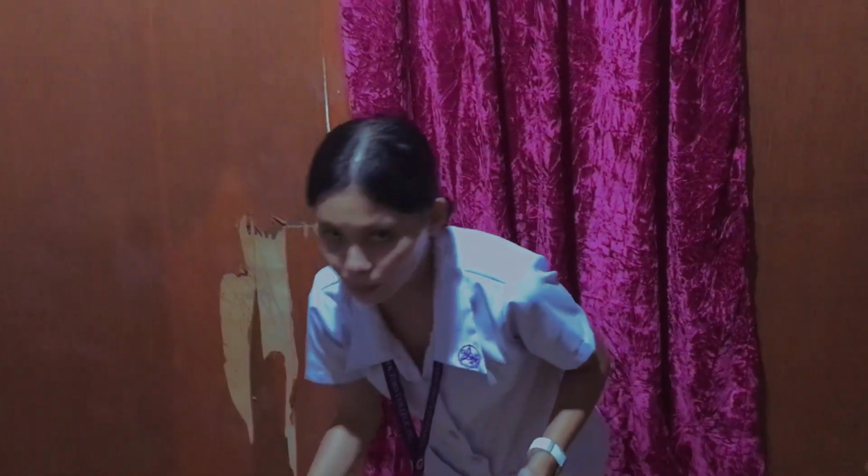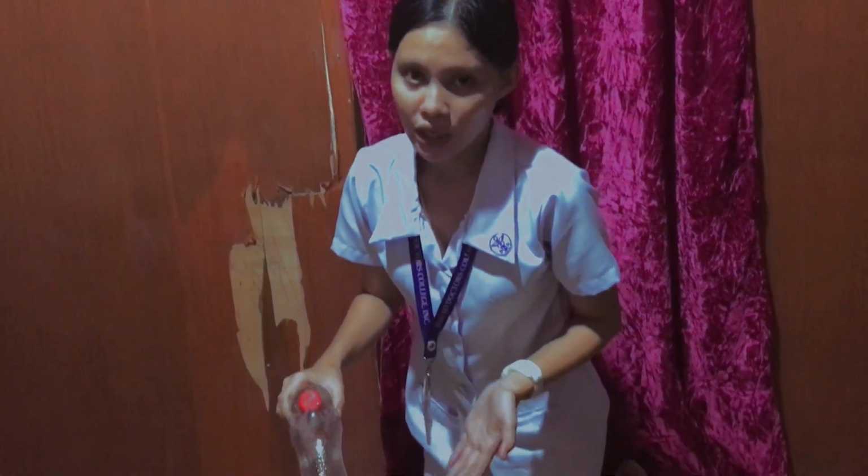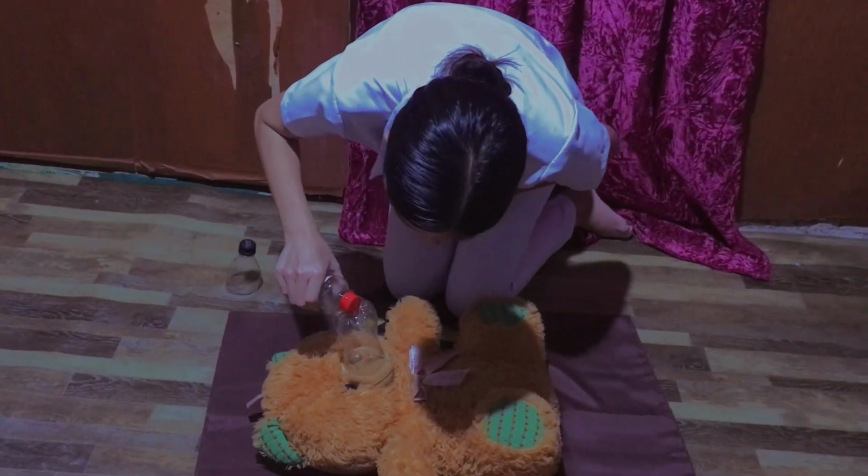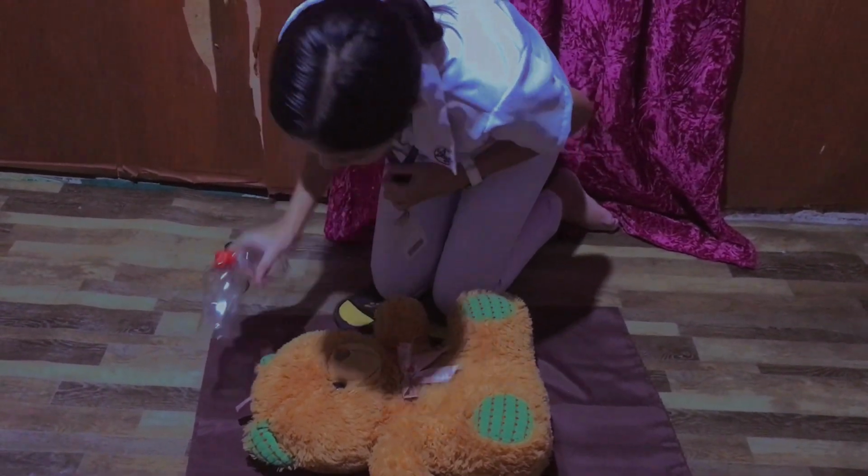So 15 compressions with 2 rescue breaths using the bag mask. 1, 2. After that, we're going to do it in 2 cycles. Each cycle should contain 2 rescue breaths. And we will also have to do that at a depth of 1.5 inches.